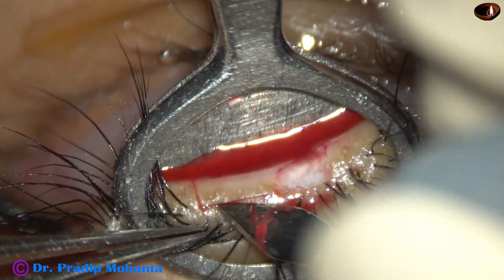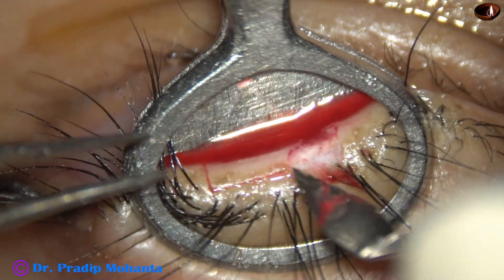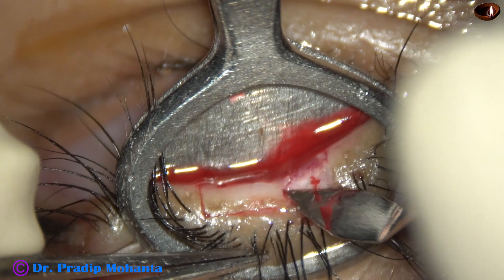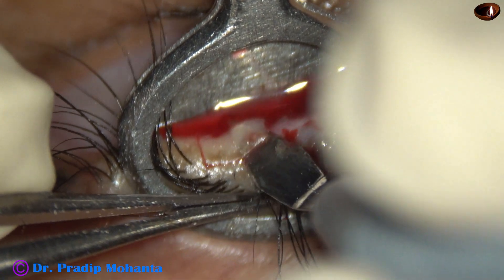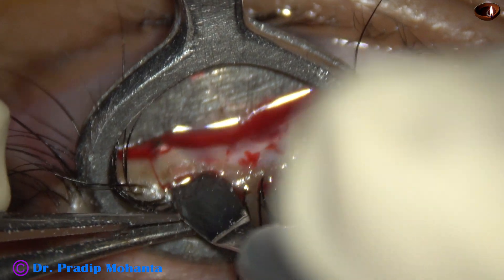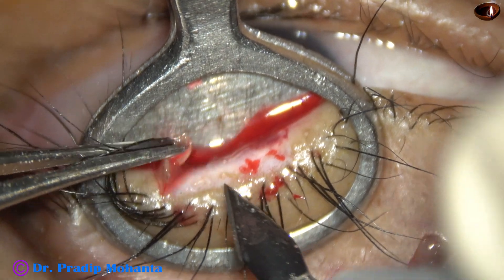This is a nice way of getting a superficial excision of the tissue. We need not cut very deep — we just have to make the surface raw, and that's it. This amount is enough.